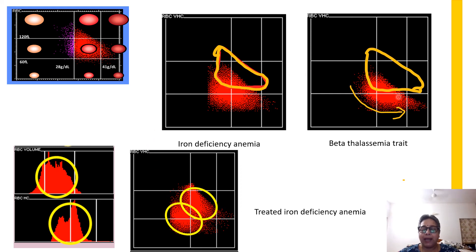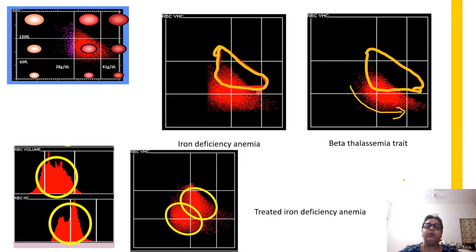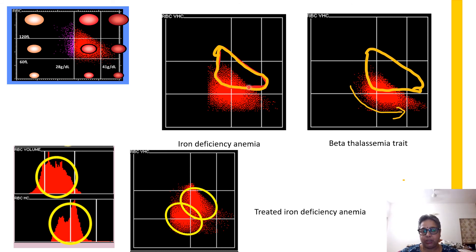These scatter plots will tell us a lot of information about what one is going to see on the peripheral smear. We are not taking away examination of the peripheral blood film because that is the gold standard. But when you look at these scatter plots, it gives you a better focus to know what you are supposed to look for in this slide so that you will be able to pick up the pathology faster and better. Your turnaround times can be improved, your interpretations can be improved, and therefore you are doing better patient care.